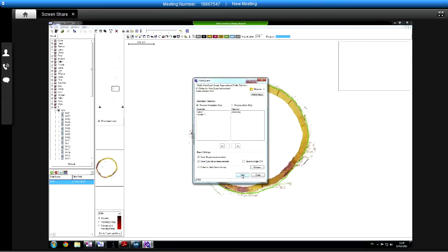Oh, now it's going to take longer because it's actually finding something to do. Oh, maybe not. You can see with this though why batch processing is useful. You don't want to have to sit here, wait for this to finish, and then mark up another one. Just mark them all up in one go.